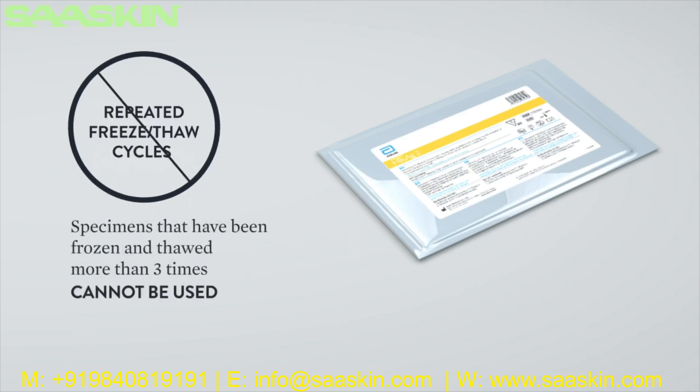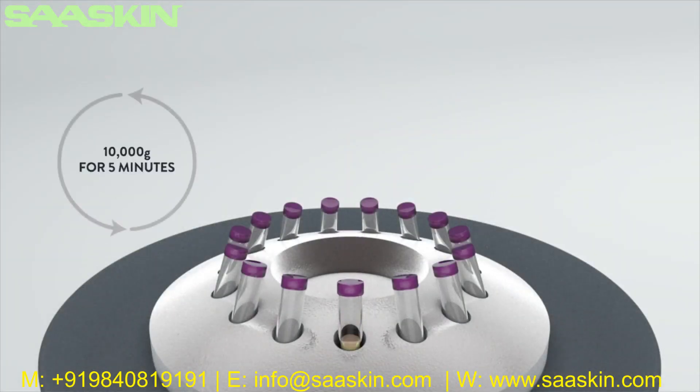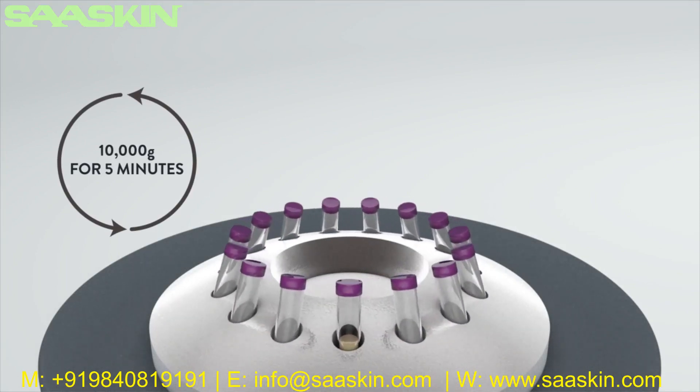Avoid repeated freeze and/or thaw cycles. If serum or plasma specimens show particulate matter or turbidity, specimens must be centrifuged at 10,000 G for 5 minutes at room temperature before sampling.